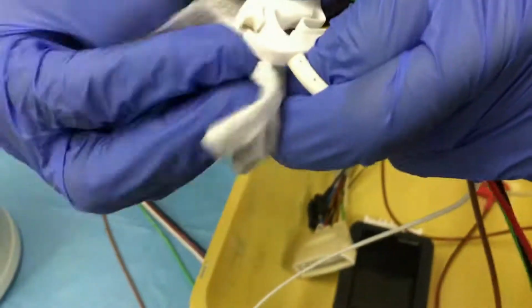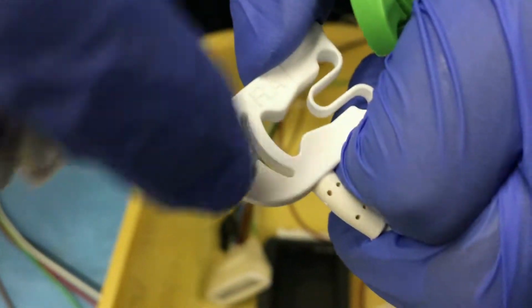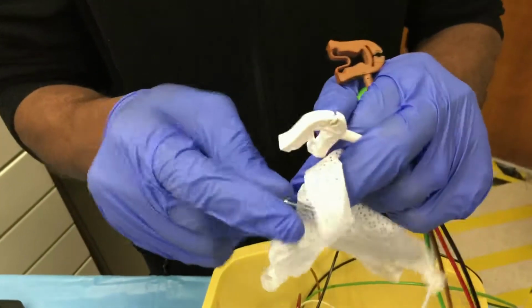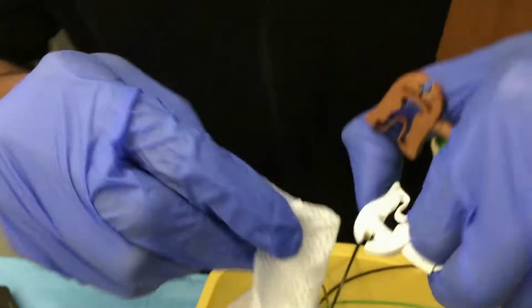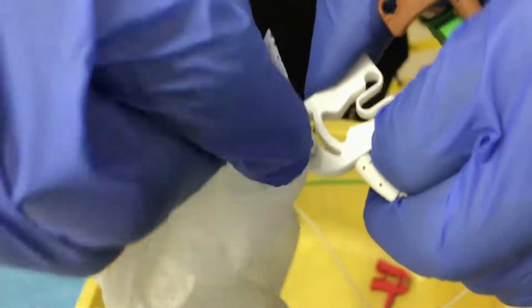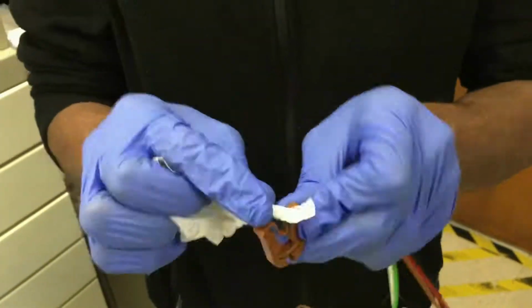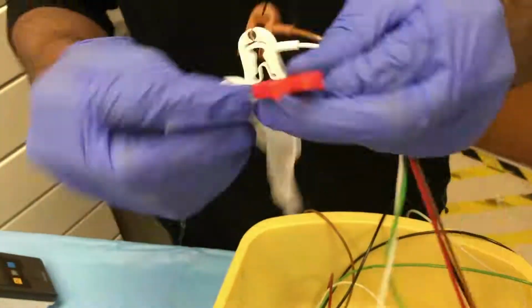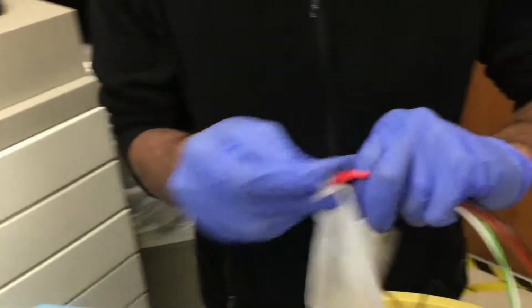Sometimes the residue may be a little stubborn, so if you find that you cannot get all of the residue out, you can use a paper clip to help pry out the remaining debris by inserting the paper clip along with the Cavicide wipe and gently pry the debris off. You can repeat this process for each chest lead with a new section of the Cavicide wipe. If your Cavicide wipe becomes too soiled and there are no remaining unused sections, simply grab another Cavicide wipe.